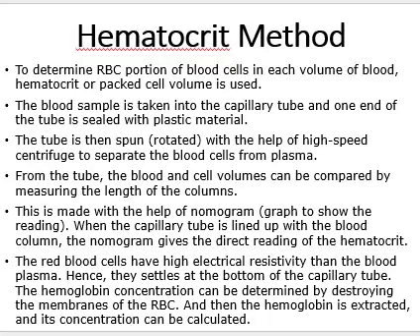In the sense, the hematocrit method is also called the packed cell volume method.